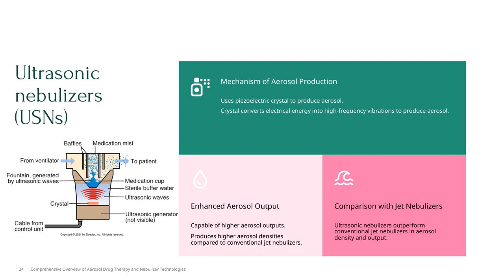Moving on to enhanced aerosol output, some nebulizers are designed to produce higher volumes of aerosol. This means they can deliver medication more efficiently, with greater density compared to traditional jet nebulizers. This is especially useful when quick or higher doses are needed.